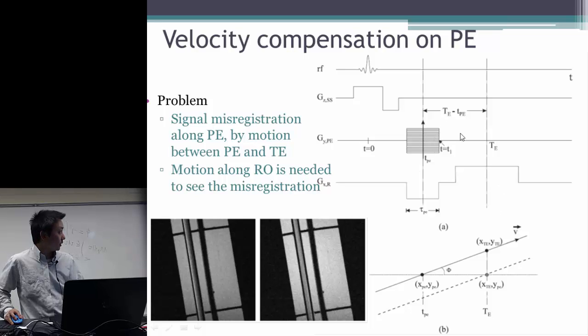But after we play out the phase encoding gradient, if the spin moves from point A to point B, during this change of location there are no more gradients between these two points. So there is no additional phase for these moving spins. Does that make sense? Because if there is a gradient here, there will be additional phase, as we saw before.